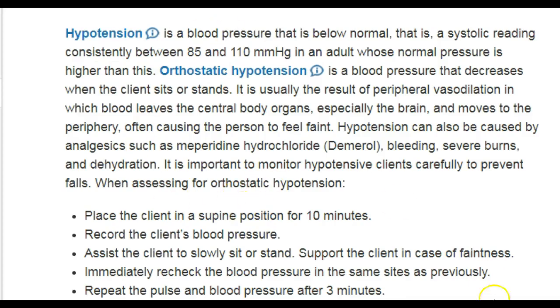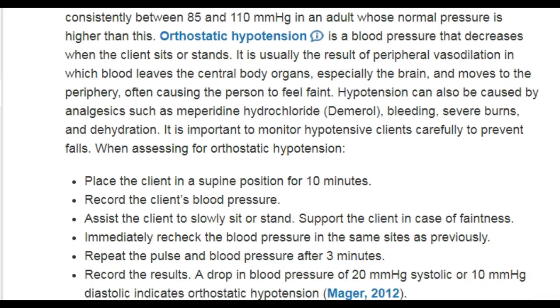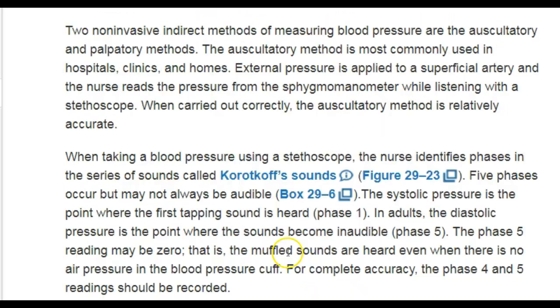Please read this area about hypotension, and in it, it tells you what hypotension is and also about orthostatic hypotension. I want you to read this area about orthostatic hypotension, as you will be asked in your nursing to do orthostatic vitals on a patient. So I don't want you to go, what in the world is orthostatic vitals? You would take the blood pressure along with the pulse and do these steps. Perform the steps. Remember, we talked about Korotkoff sounds. So it's here, but I will refer you back to ATI so you can see the video for it.